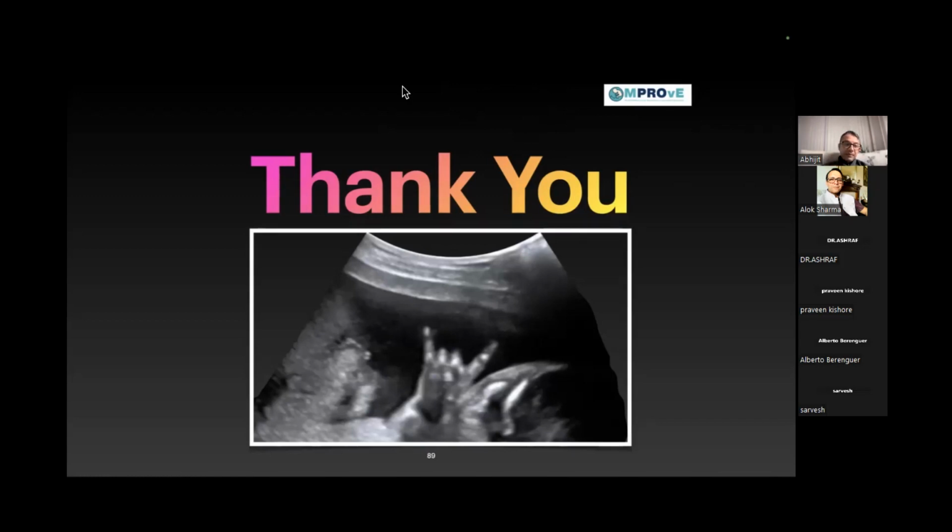Okay, so again, first of all, it's the baby we are trying to, the pathology we are trying to find out. So the clinical context, clinical background, why you have been approached, or why do you think you need to do the lung ultrasound? Number one. Number two, if you are thinking that it might be a case of a pneumothorax, or you're not able to think of what pathology you're dealing with, you try to go and scan the area.